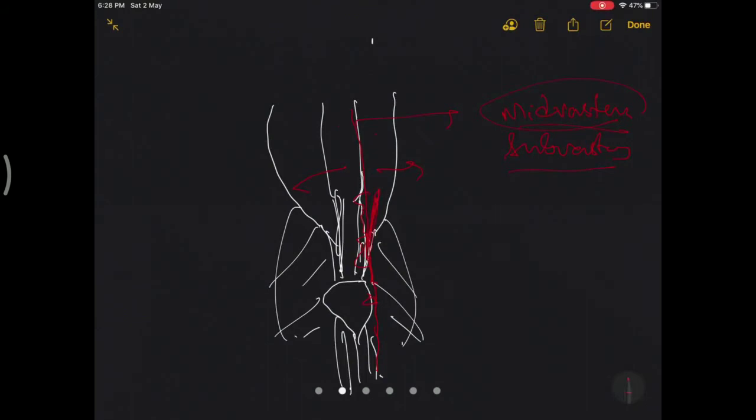Since it is just a split along the fibers, there is no actual cutting of the muscle fibers. They observed these patients to have quicker rehabilitation and less extensor lag.